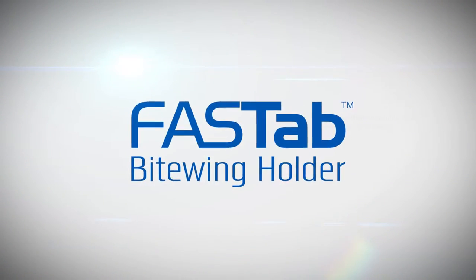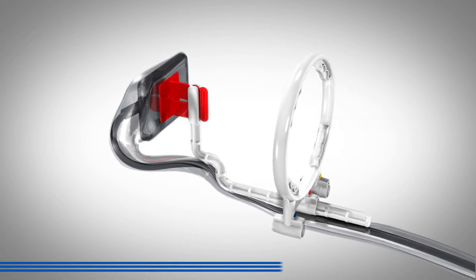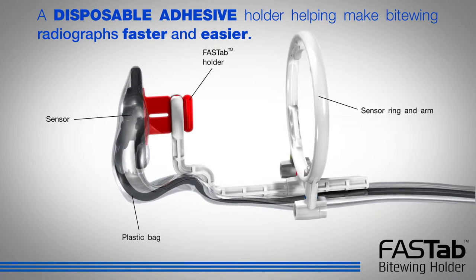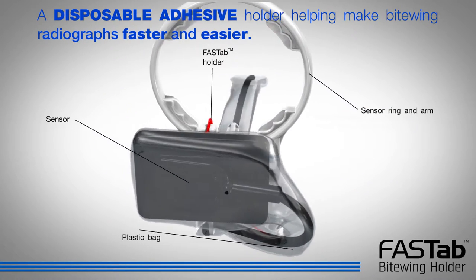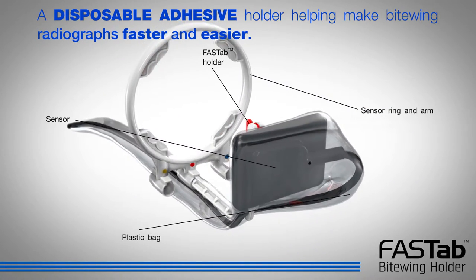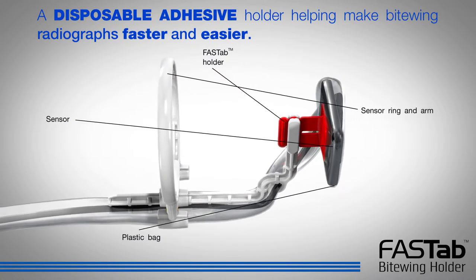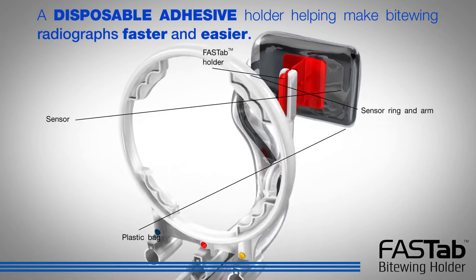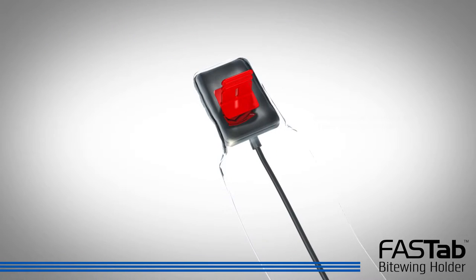FASTab Bitewing Holder. Part of our complete disposable solution, the FASTab is for clinicians seeking improved productivity when taking bitewing radiographs. The FASTab holder is indicated for holding digital sensors for intraoral dental radiographs with Rinn-tight sensor covers and provides enhancements for ease of use, accurate imaging, and patient comfort.